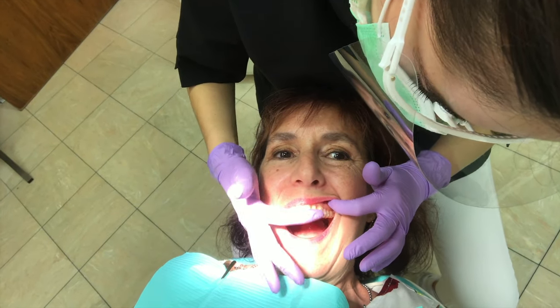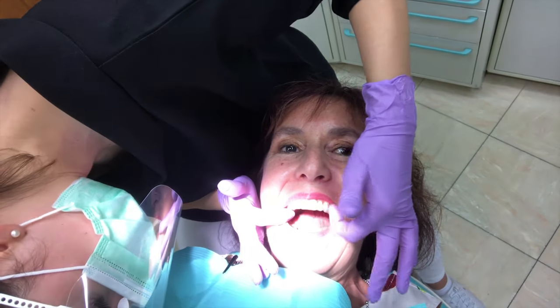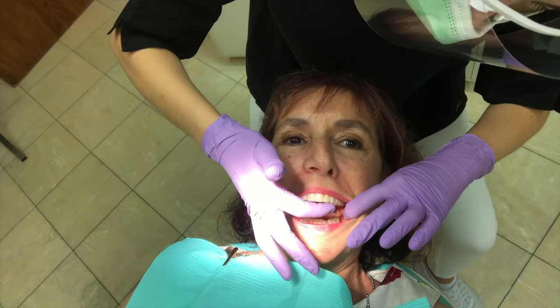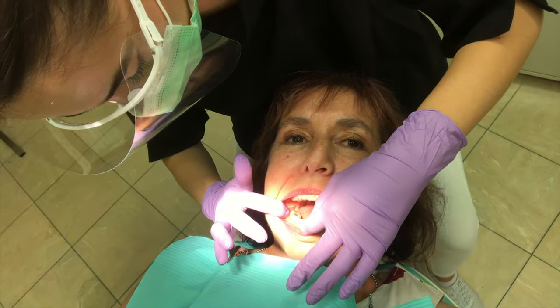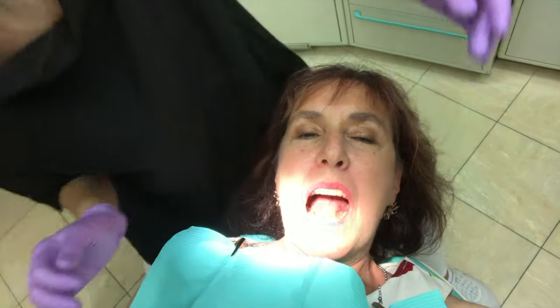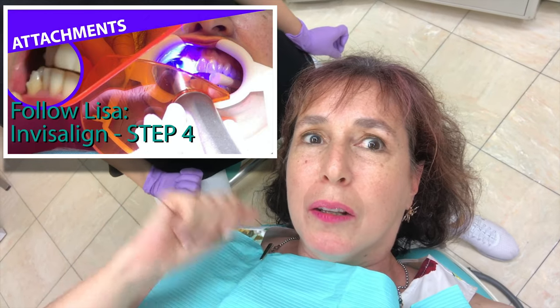This one is not bad. I'm going to remove all the attachments at the back, so we are going to spend some time removing attachments — it's not going to hurt. I won't be filming putting the attachments on, because I have a separate video — I'll put a link right here — where you can watch a whole video about how Joanna put on the attachments last time.